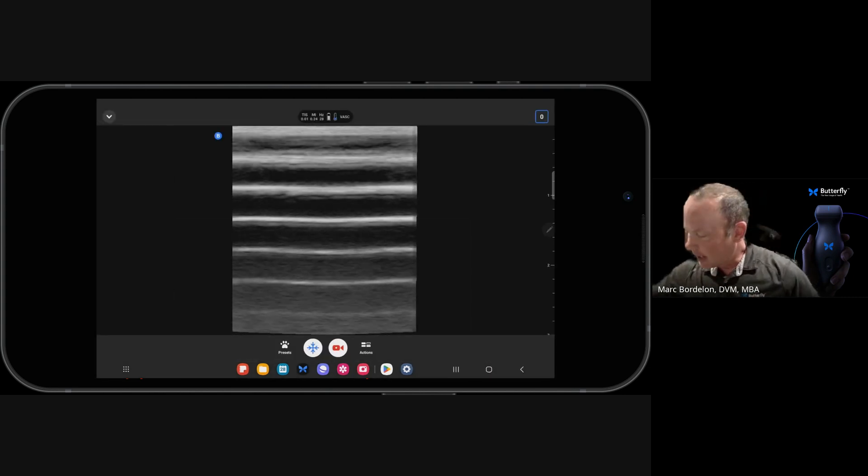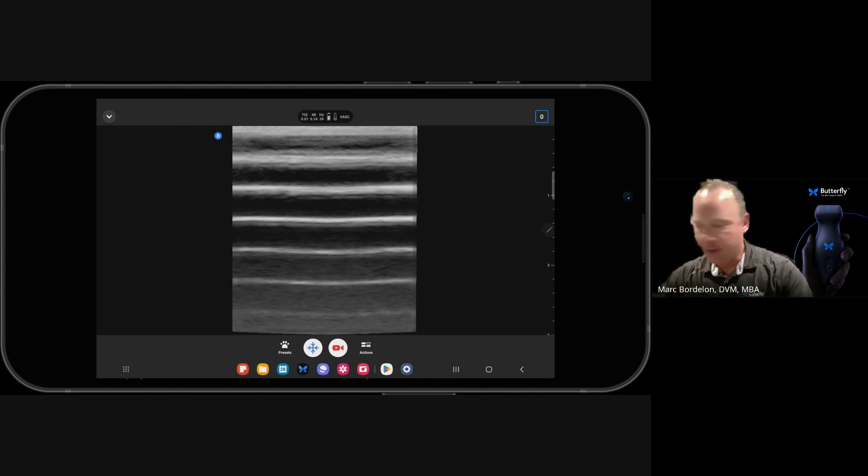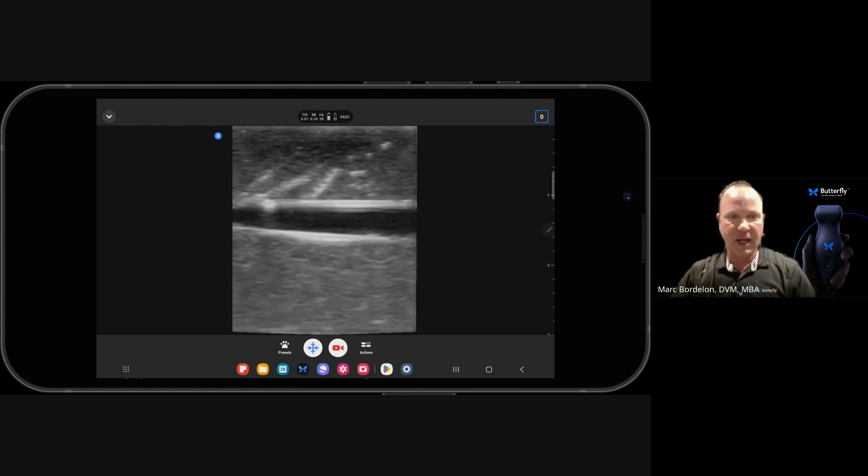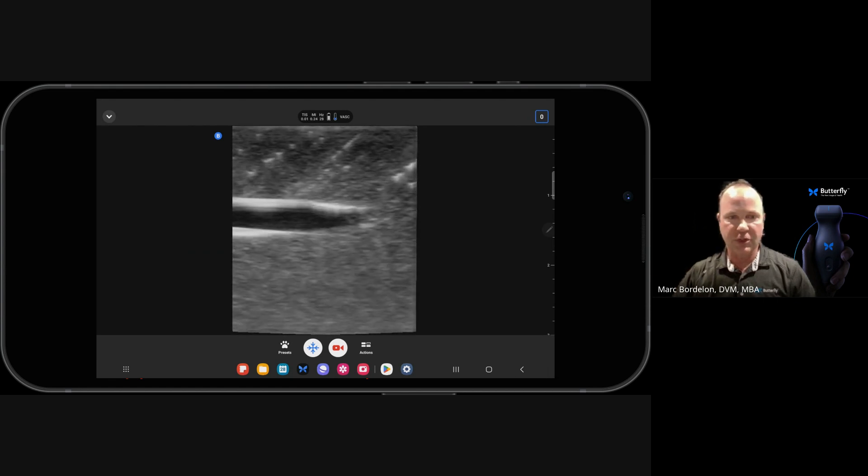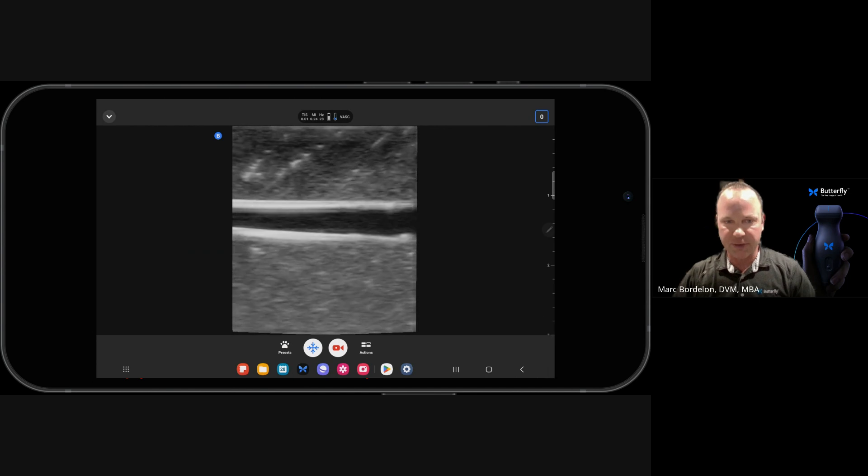So as I start to scan this structure, what we'll see is a red rubber tube that is that hypoechoic linear structure here, and that's going to be what we're after.